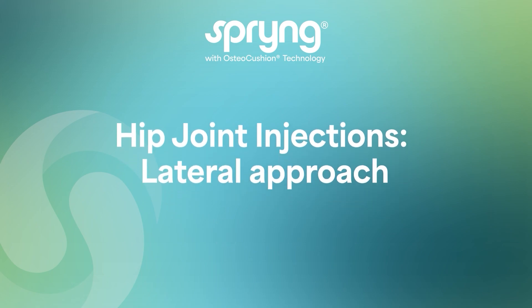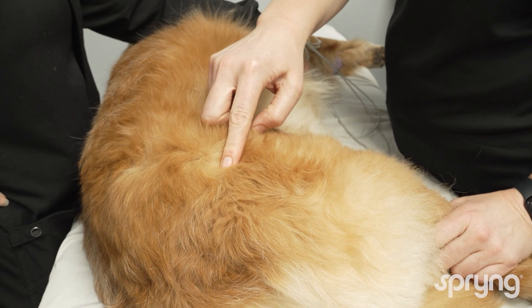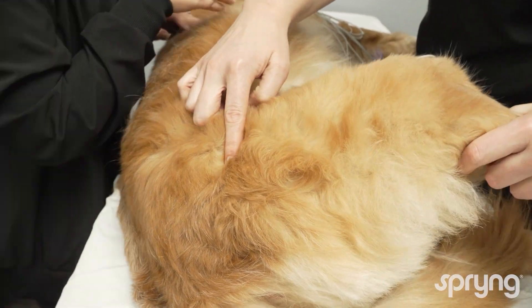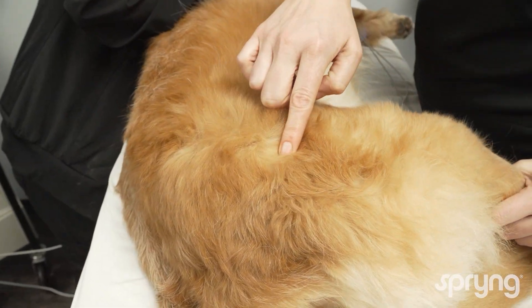Hip joint injections, a lateral approach. Begin by sedating the patient, placing the patient in lateral with the affected limb up. Identify the greater trochanter, and confirm by performing abduction range of motion.